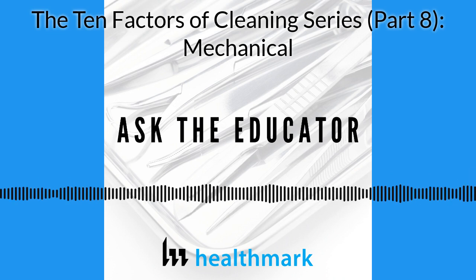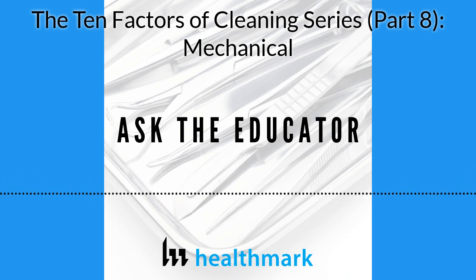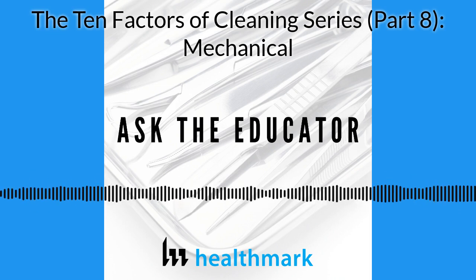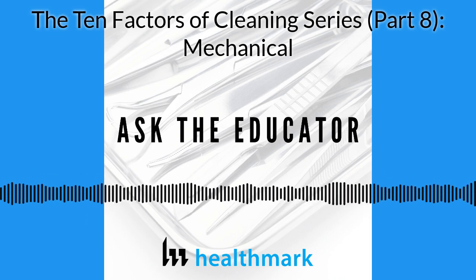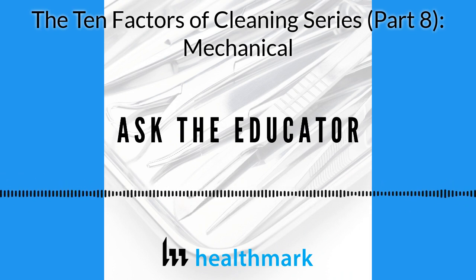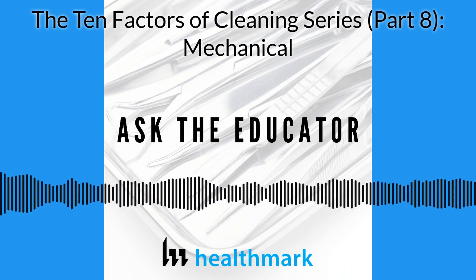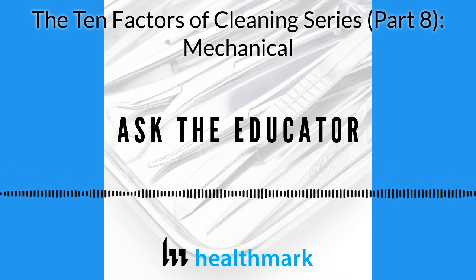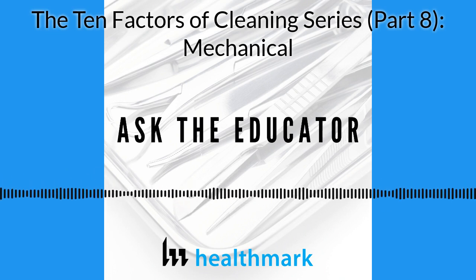There are all these mechanical pieces when you put man and machine together, because we're not going to talk about loading, that's more human factors. But you've got to make sure the equipment's running properly. And what are you looking to make sure is running properly? In your department, you probably have a sonic. If you're lucky, you have a cart washer. And if you're lucky, you have an automated washer. And you might even have some of those pumps that you hook up to your manual system.